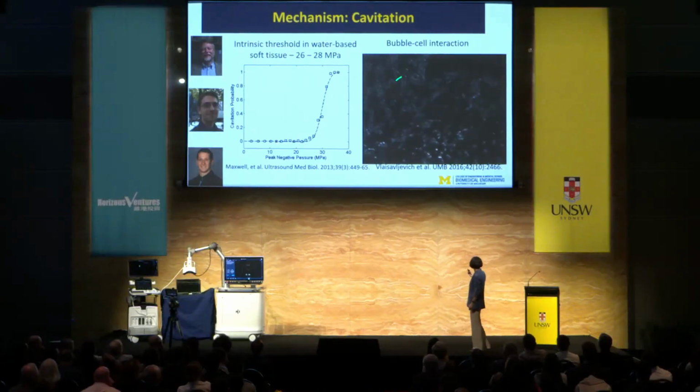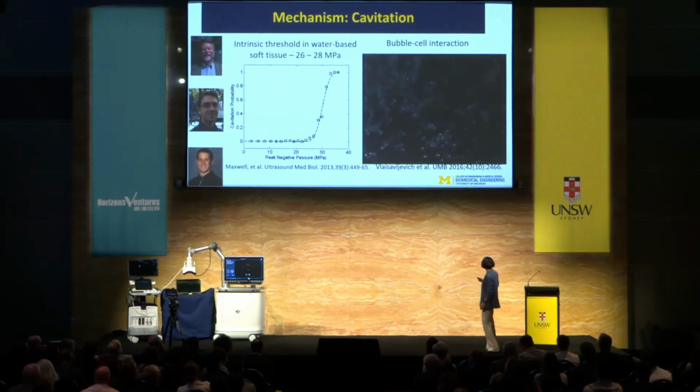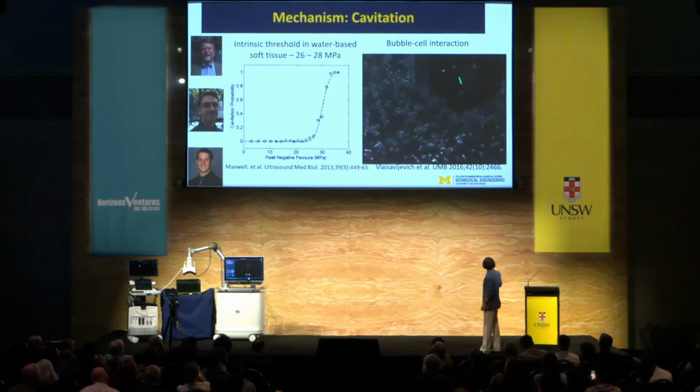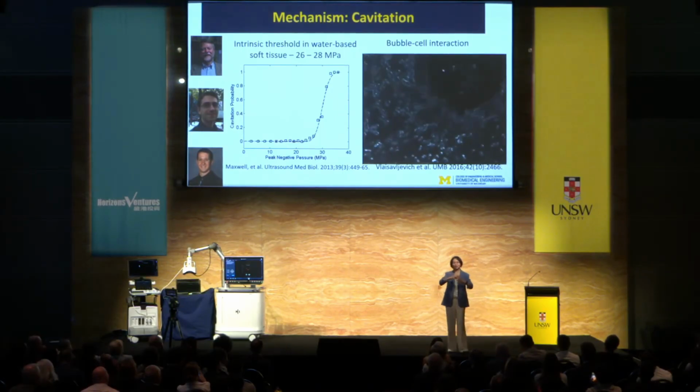This video is taken under a microscope using an ultra-fast camera, so the activity you're about to see happens within 100 microseconds, and then is slowed down tremendously for you to be able to visualize. What we're seeing here, those white structures, are breast cancer cells embedded in a clear tissue-mimicking gel. And the black structures here are microbubbles generated, but they coalesce into one big one.